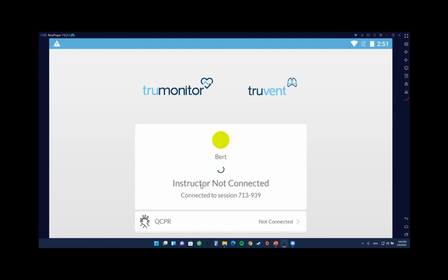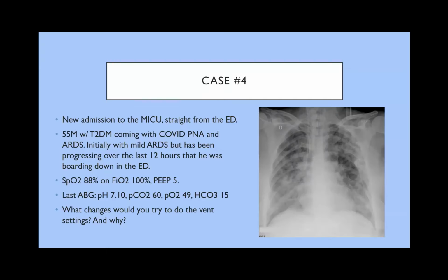So you go to that tidal volume based on 60 kilograms, you go to that rate of 30 breaths per minute. You go up on that PEEP to 10, and you're going to keep that FiO2 at 100, right? Because you cannot start titrating an FiO2 when the patient is still adjusting to the ventilator. So you have to give that time to the PEEP to work before you start changing your FiO2.